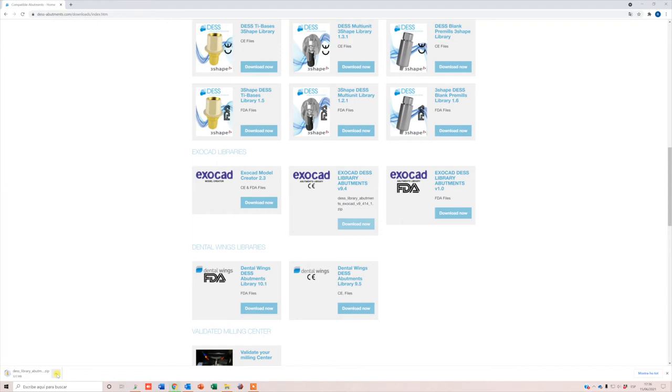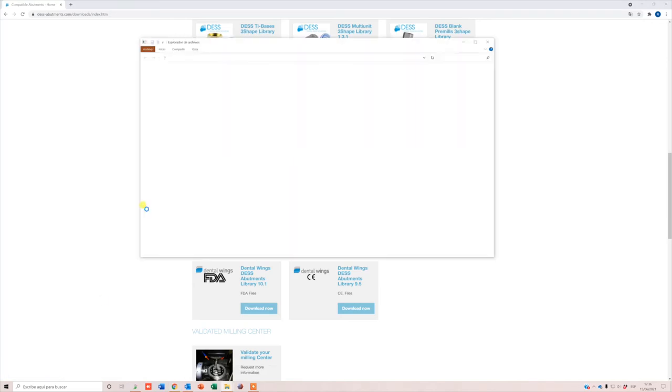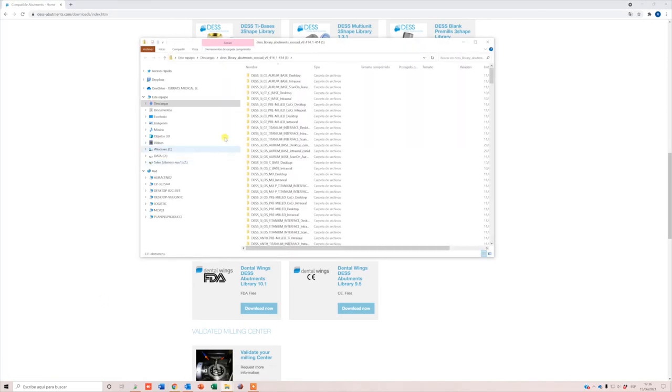These are free to download. Once the library files are downloaded, unzip the folder, open the folder, and copy the files.